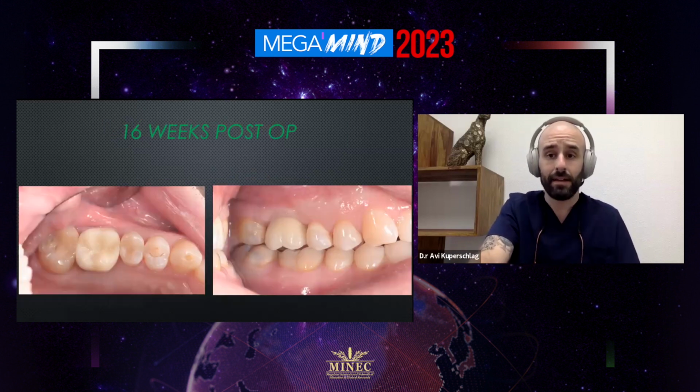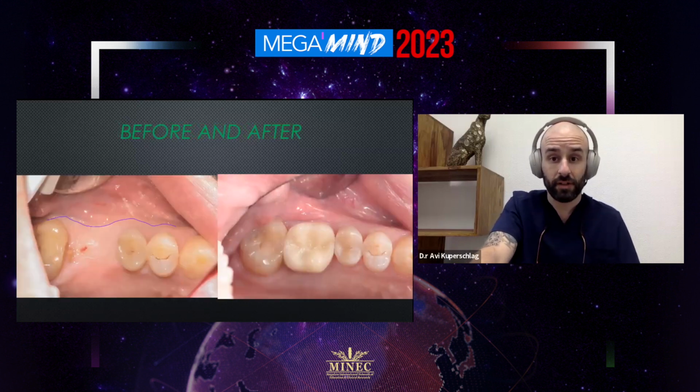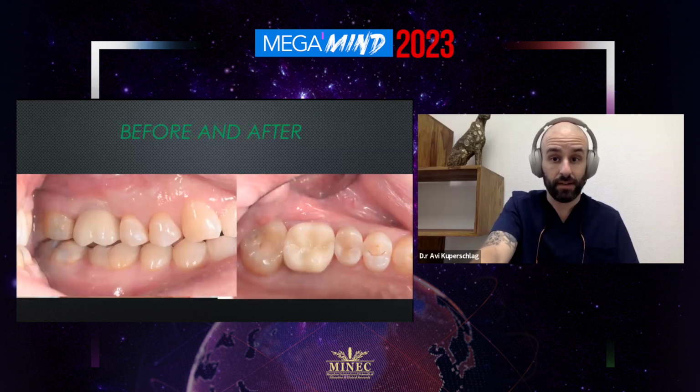We give away a monolithic zirconium crown. The subgingival part is non-glazed. According to the zero bone loss concept, it's highly polished. Our technician really takes his time to polish it nicely. And we give away the crown. This is how it looks. This is before, after, and after.